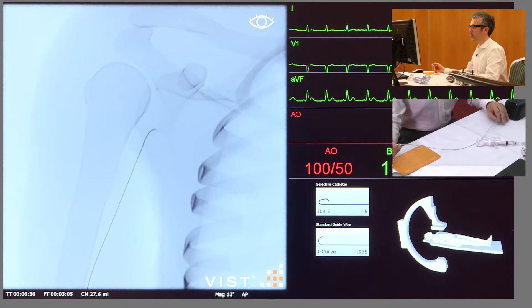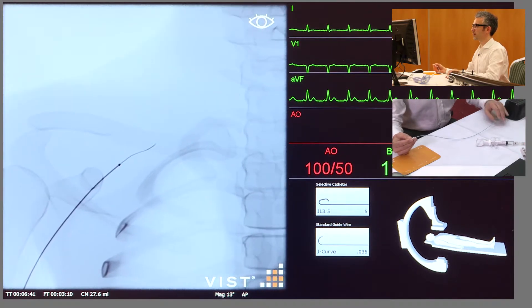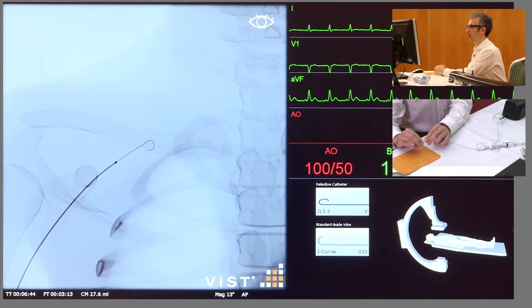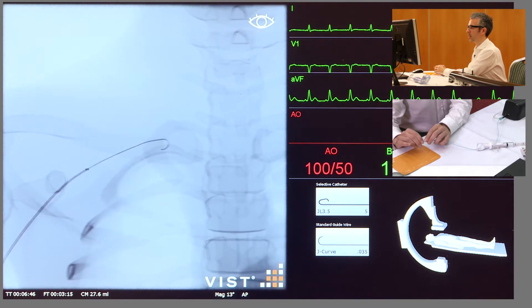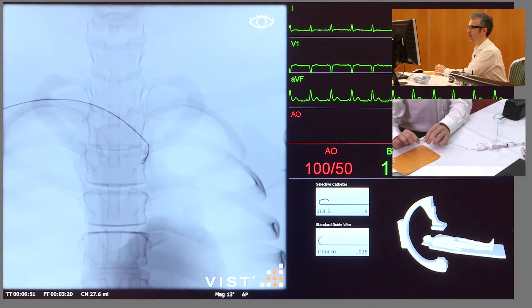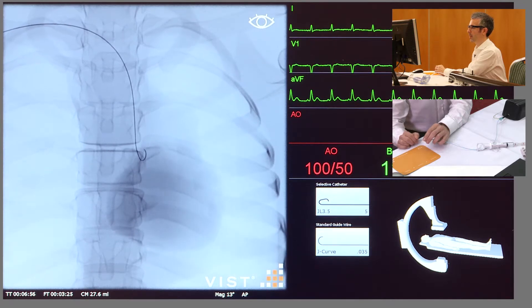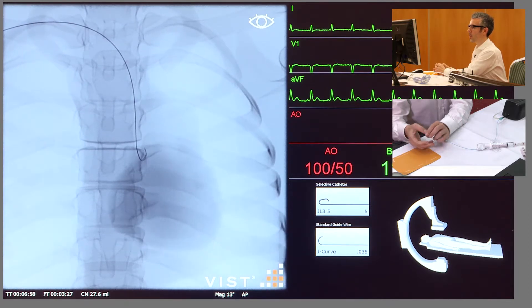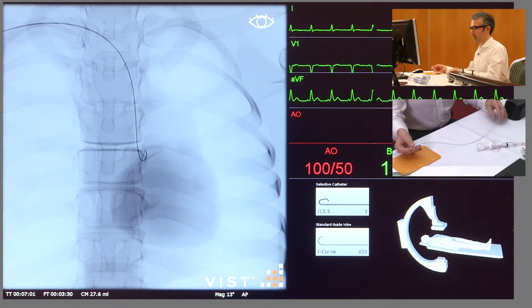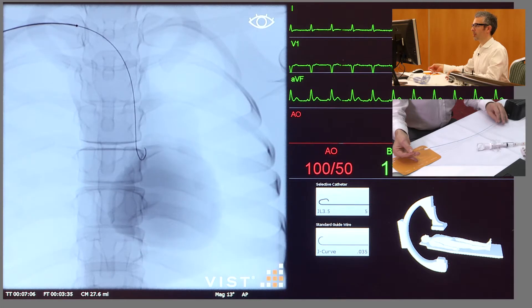I'm just moving guide catheter and wire together now up through the subclavian artery, and as we advance the wire here we're being careful to avoid going into the head and neck vessels. The wire tip is now advancing down the innominate and heading into the ascending aorta, and just there I could feel the resistance as the wire came up against the aortic valve. So I'm going to fix that wire there now, and with the wire position fixed I'm advancing the catheter over the wire and down into the aortic root.